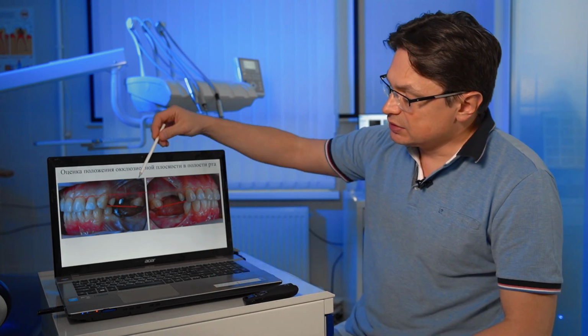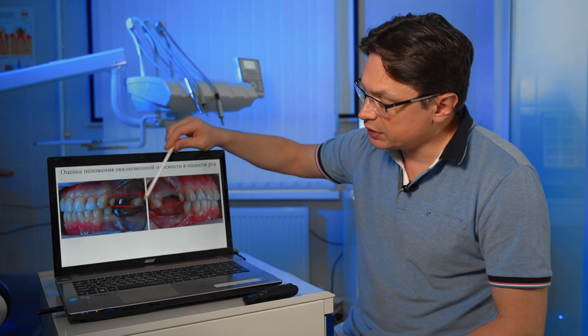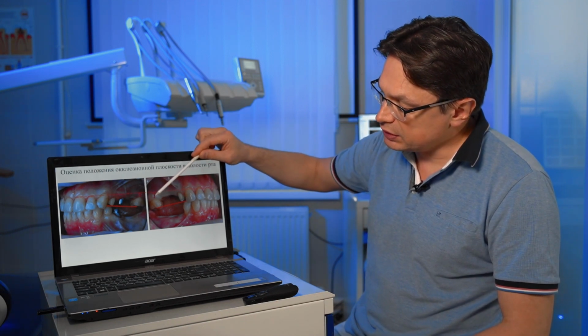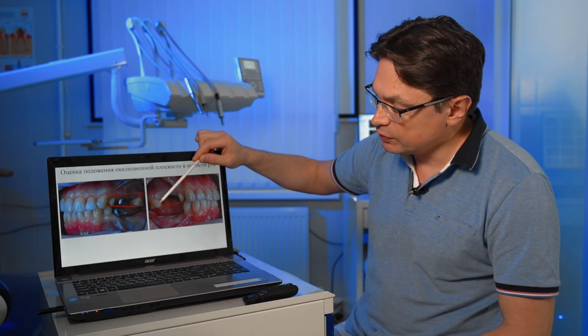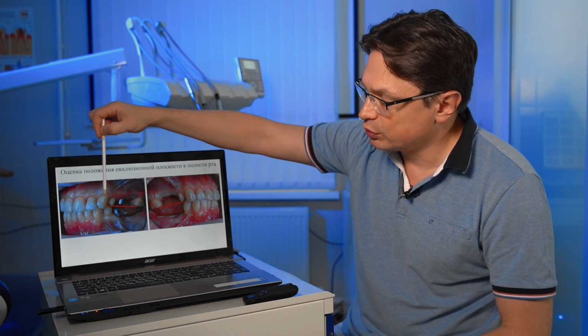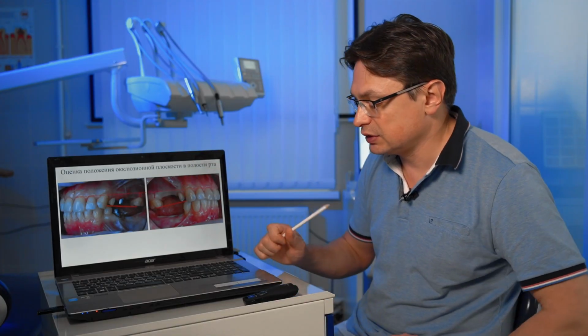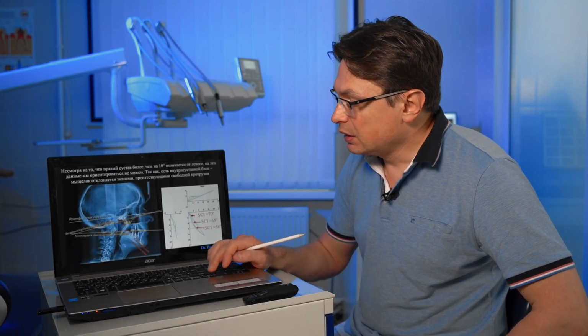And pay attention to the situation in the oral cavity, assessing the cephalometry in parallel. Tooth 1.7 is extruded, and you see that the distance from the needed occlusal plane has changed. It is related to lower tooth loss in the past. So it is an absolute certainty that prosthetics will be provided to these teeth to change the occlusal plane angle and to get these teeth straightened. The same situation is on the left side.